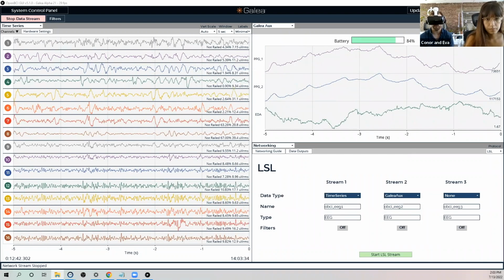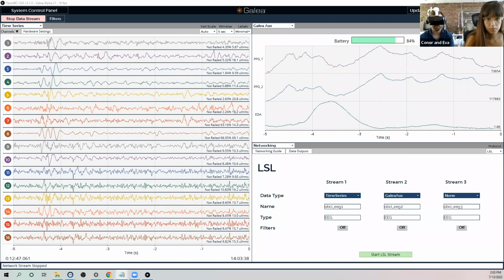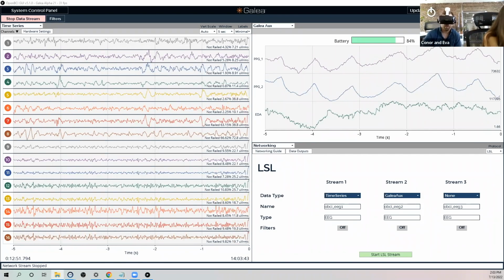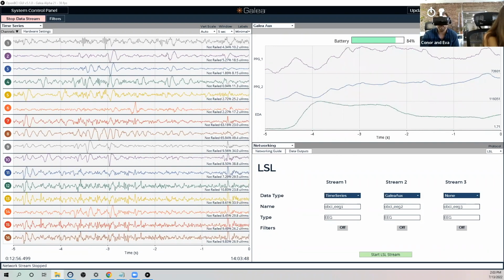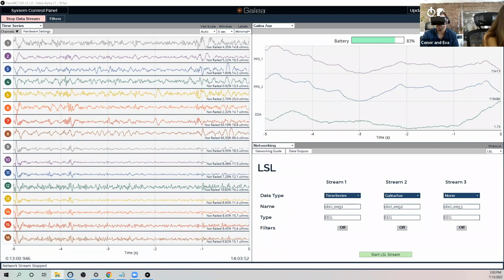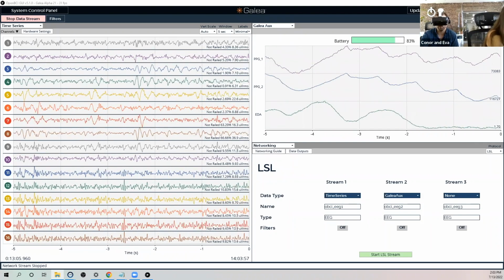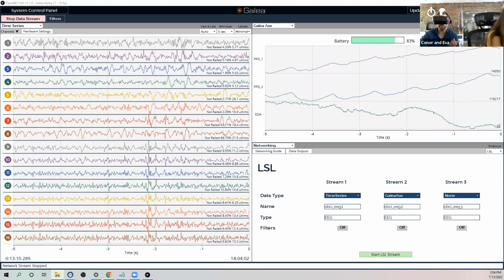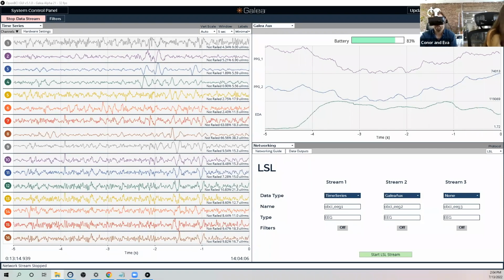So there's obviously still room for improvement in terms of trying to get the headset to easily fit all head sizes and head shapes, but we've done a lot, and we've also been tackling that problem gradually over the last decade. And as complicated as the electronics and the radio and all that stuff is for dealing with physiological data, I do believe that the hardest challenge is actually the ergonomics. It would be really easy if we were designing a custom headset for everybody and we could 3D scan ahead and then design a headset based on a 3D scan.